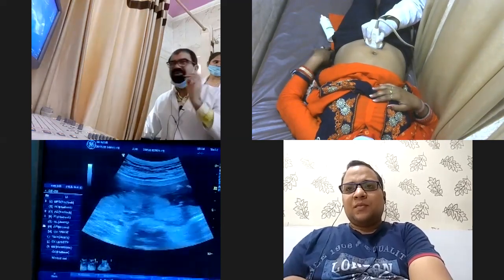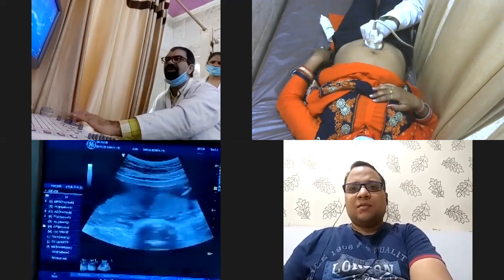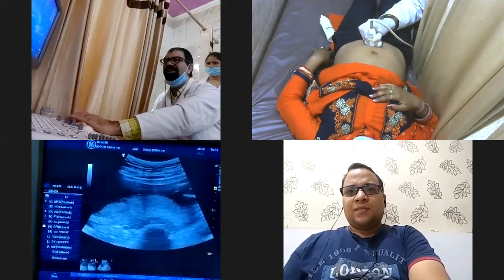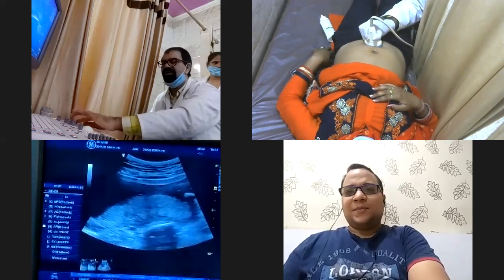Yes, sir. This is my promise that you can make out. Now I am giving myself a challenge, because now I am dealing with a person who has never seen the fetal ultrasound. Am I right? Yes, sir. Now let me freeze this image.